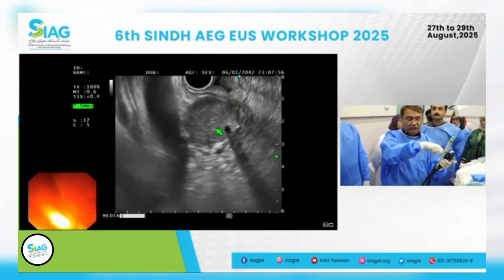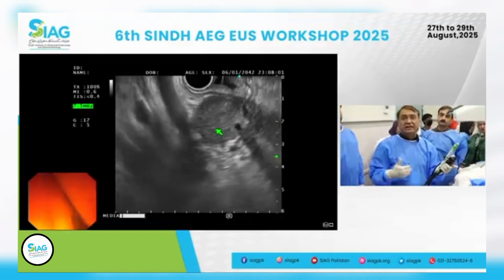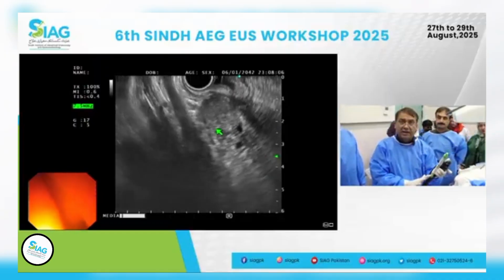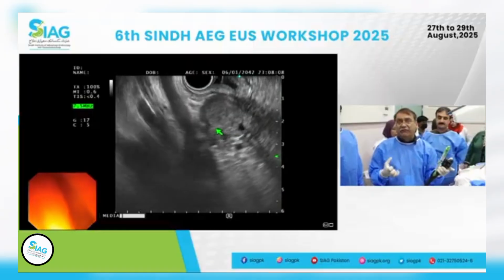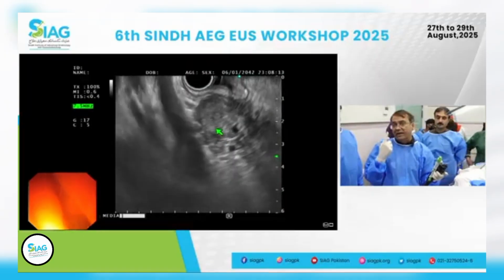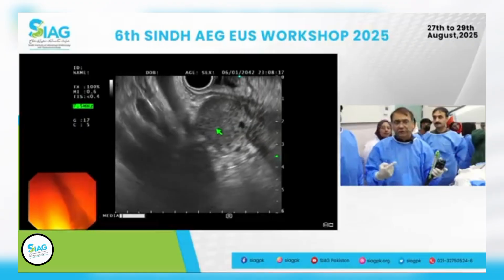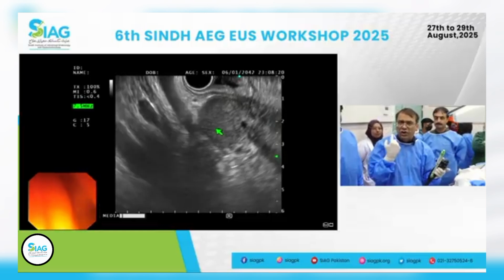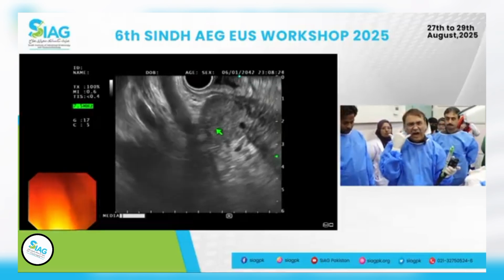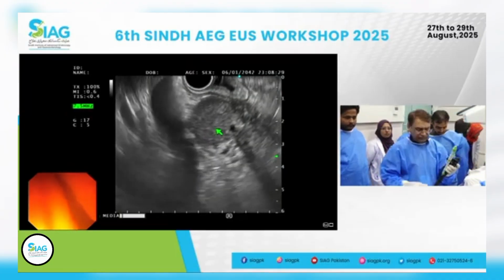So you don't have to struggle and go behind and try to open or close that, to make things easier. So the engineers who made these needles, they are pretty smart, but they forgot to tell people how to put that onto the scope. So that's how you do it. It's usually between 1/2 to 3/4 of a turn. If you use a Shark Core, usually it's between 1/2 and 2/3. But this is a 3/4 of the circle, and it will come to the right.